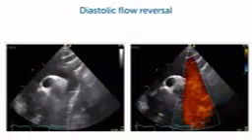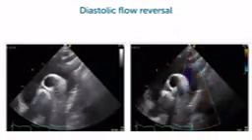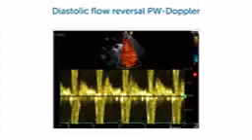Yes, and if you look at the pulsations of the aorta, they're very vigorous, which means that aortic regurgitation is probably severe. This is an indirect sign. Now, if you put the pulse wave Doppler somewhere right here, you will get a spectrum that looks like this. And again, consider diastole. So you see most of this reversal flow happens during the early diastolic period, but stays high. Well, Anna, I think we have to stop here because we're going into too many details that we actually want to show you in the masterclass.